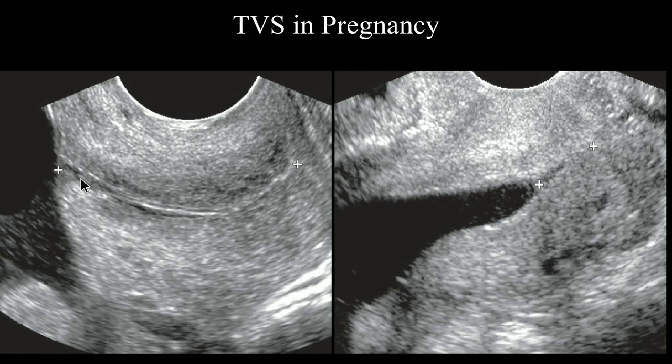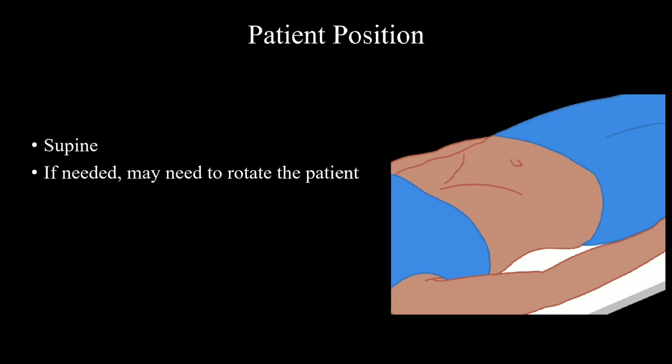Here on the left, you can see a normal cervix on TVS. The cervical canal looks good. But on the right, you can see a narrow canal with V-shaped or Y-shaped indentation of the sac into the canal. It suggests cervical incompetence. We will talk more about cervical incompetence on a separate video.